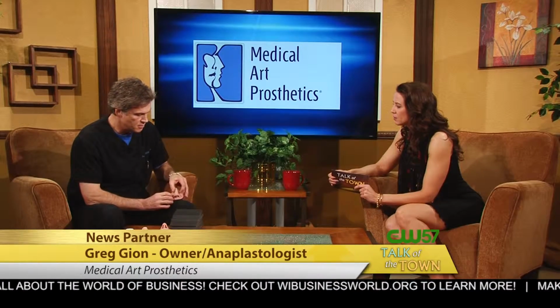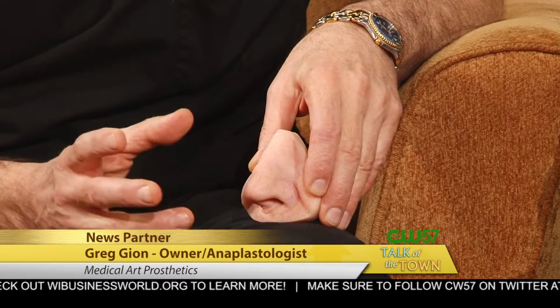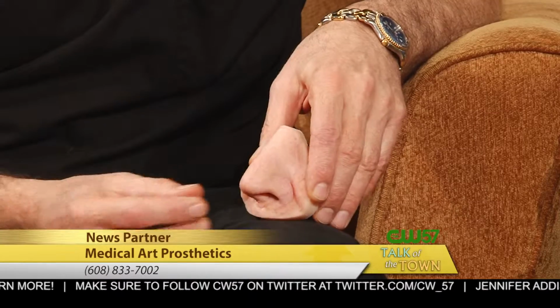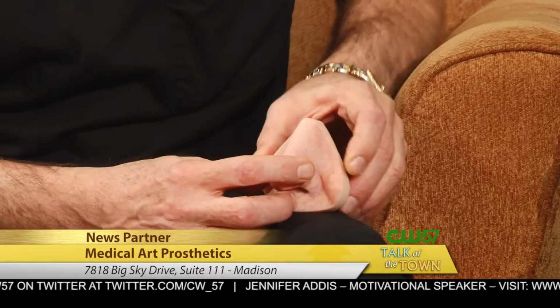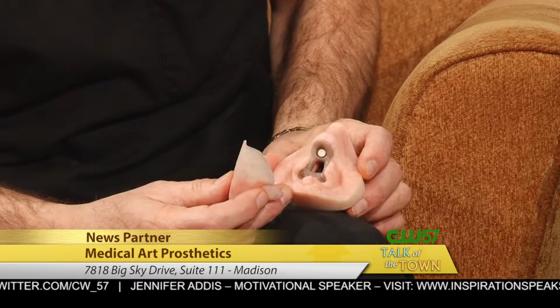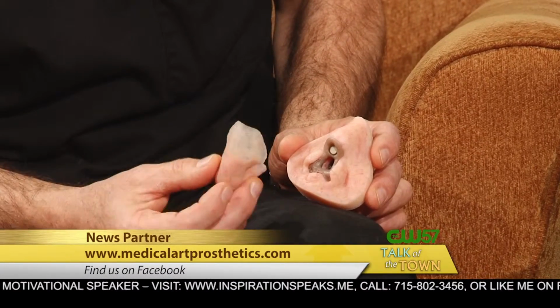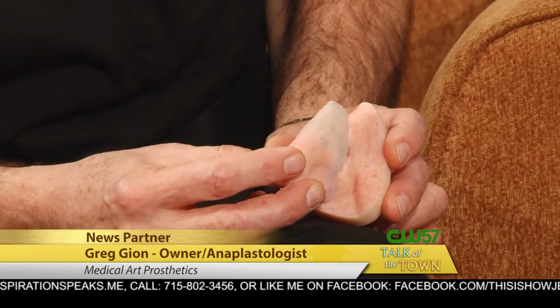What are they made of? Most prostheses, I'd say about 95% of the nasal prosthetics that I make, are silicone. Silicone rubber. So it's a soft, flexible material. This is just an example so people get a quick feel for what this actually is. It's not a surgical replacement. It's actually a prosthesis that goes on each day and is taken off and cleaned.